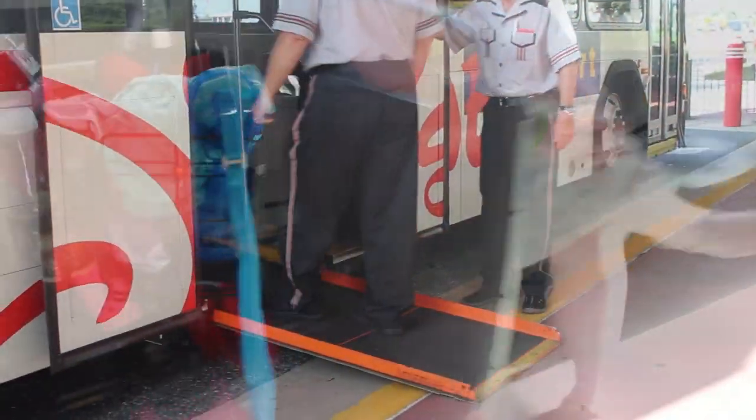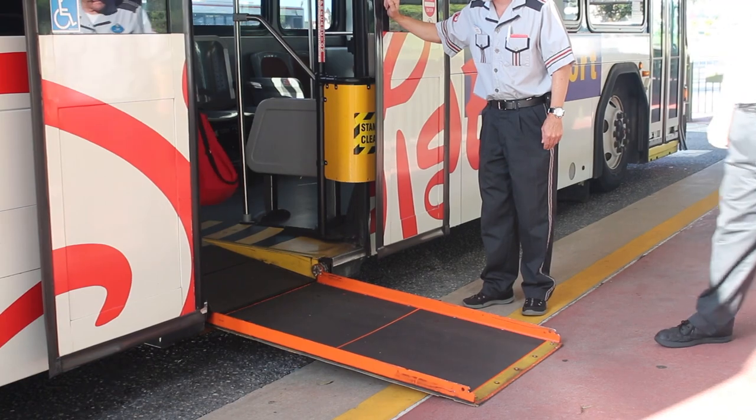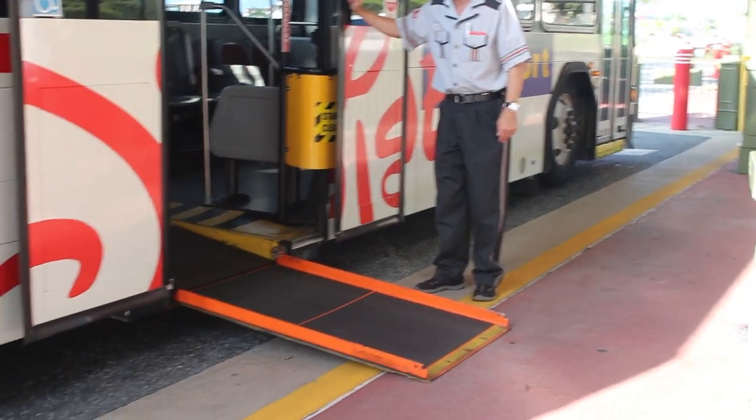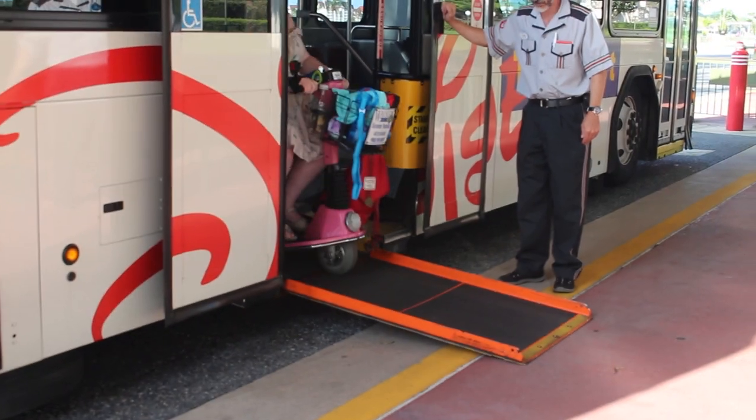You will be the last to get off the bus, and you will wait until they give you the go-ahead. This is important — they'll tell you to keep straight, so don't turn until you get off that ramp.